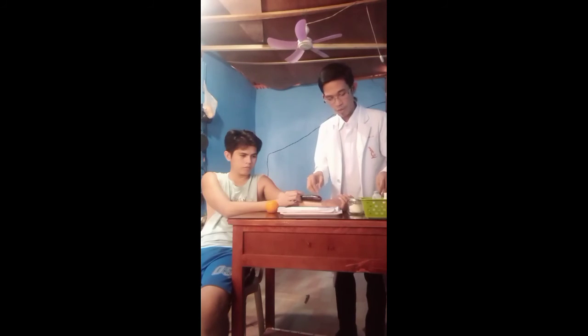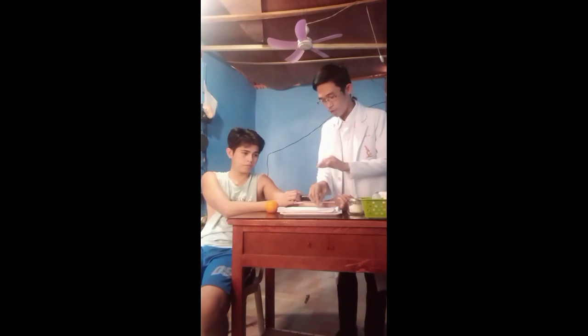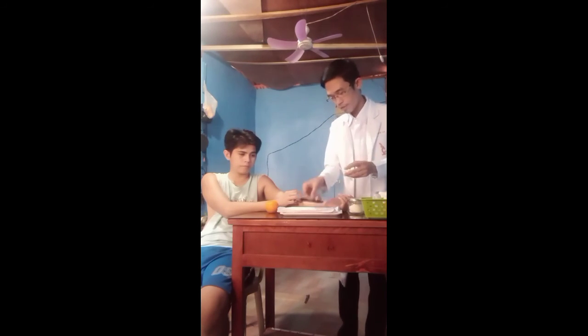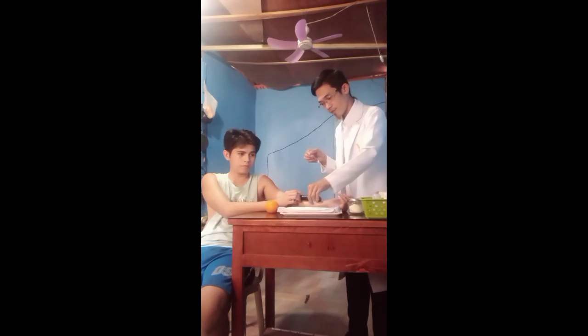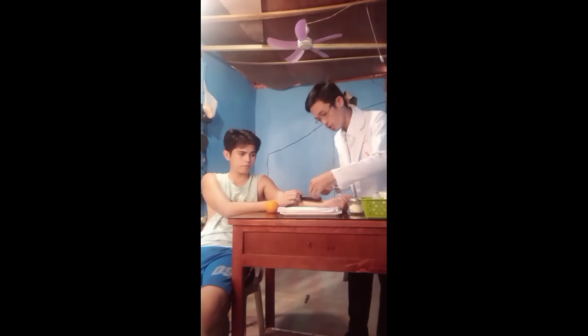Put it in the waste receptacle. And after cleaning the site, get some dry cotton for after injecting. Remove the cap slowly and then do the 90 degrees for the injection.